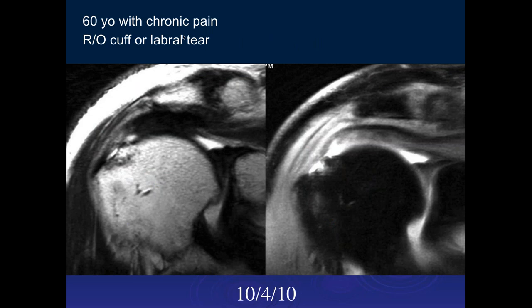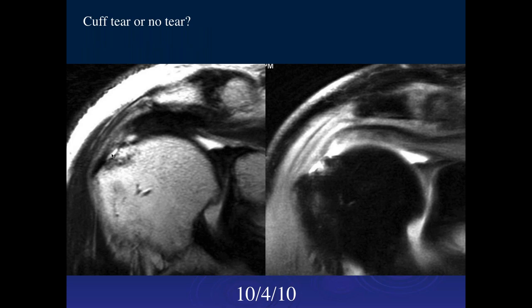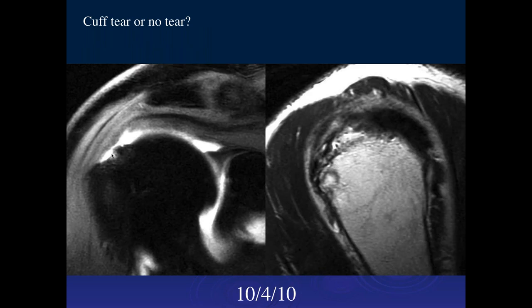Here's a 60-year-old with chronic pain — rule out rotator cuff tear. What do you think of this? We have a high-grade articular surface tear of the supraspinatus with some traction cystic changes at the greater tuberosity attachment. When I say high-grade, it looks like it's more than 50 percent of the tendon thickness. So you think this is a partial tear, not a full thickness tear?